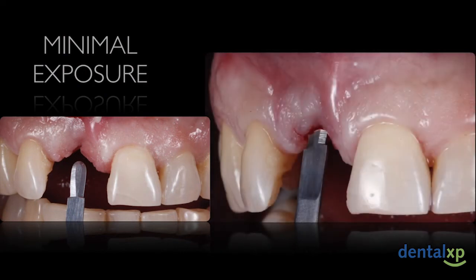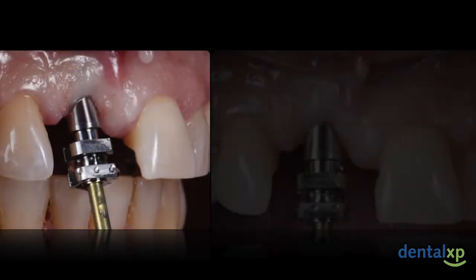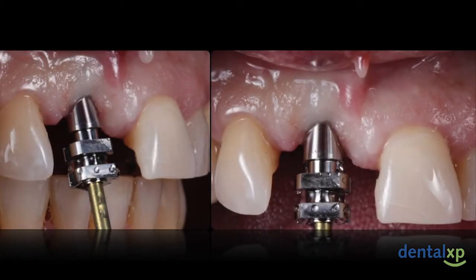So provided we have sufficient information from the CT scans and we know that we have enough bone around this implant, really we don't need to reflect any flaps to assess the bone around the site. All we need to do is a small slit incision or punch, if you will, to allow access to the implant and to the restorative components. So we then proceed with taking the impression. The impression coping was placed and the impression was performed to help fabricate a temporary crown for this implant.